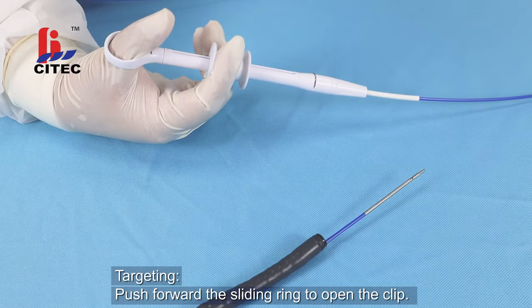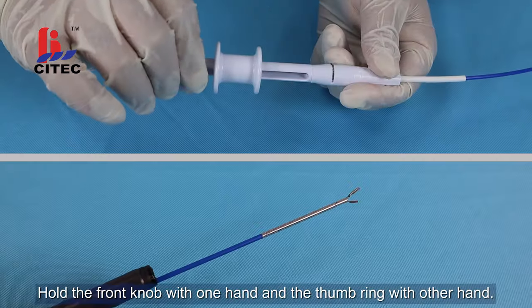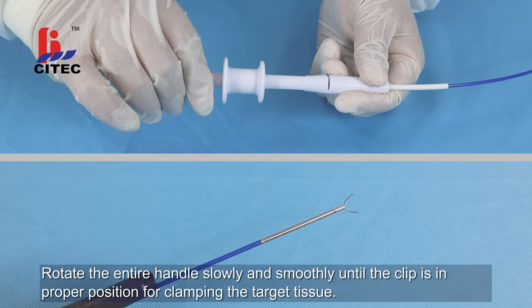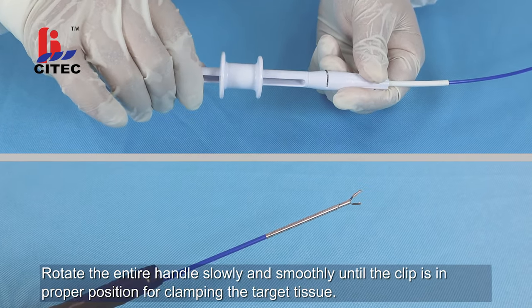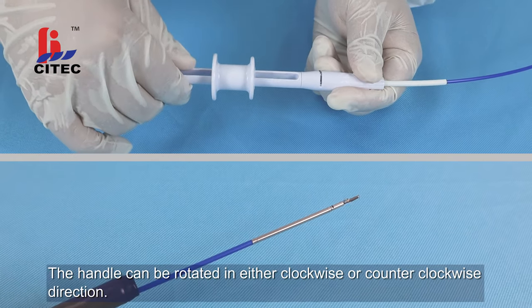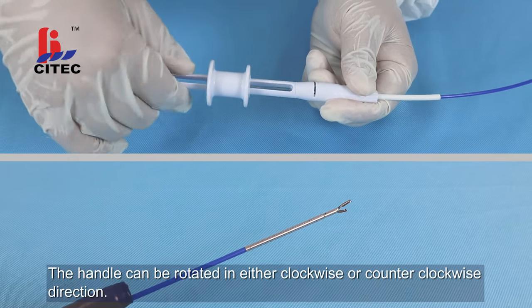Push forward the sliding rings to open the clip. Hold the tapered rod head with one hand and the thumb ring with the other hand. Rotate the entire handle slowly and smoothly until the clip is in the proper position for clamping the target tissue. The handle can be rotated in either clockwise or counterclockwise direction.